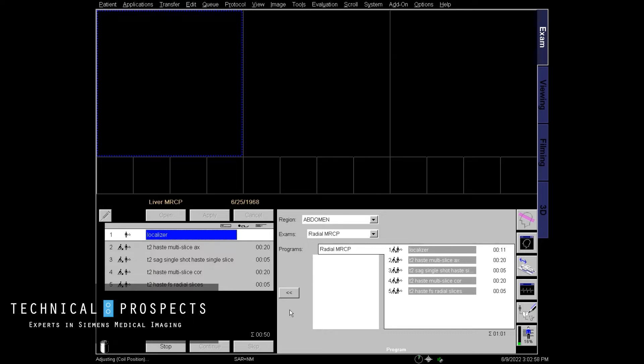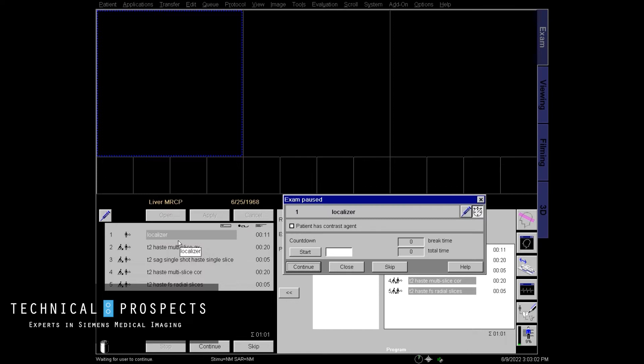So today we're going to talk about radial scanning for MRCP liver. I'm going to start off obviously with a few pre-scans before we start this.